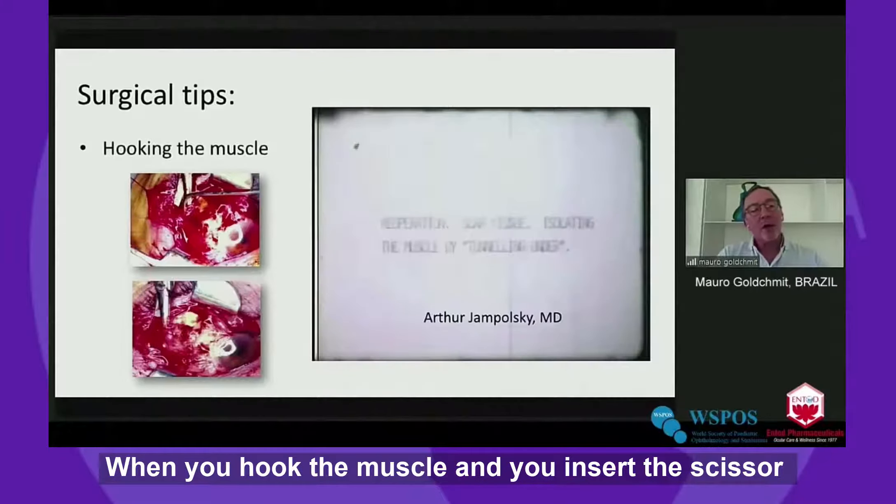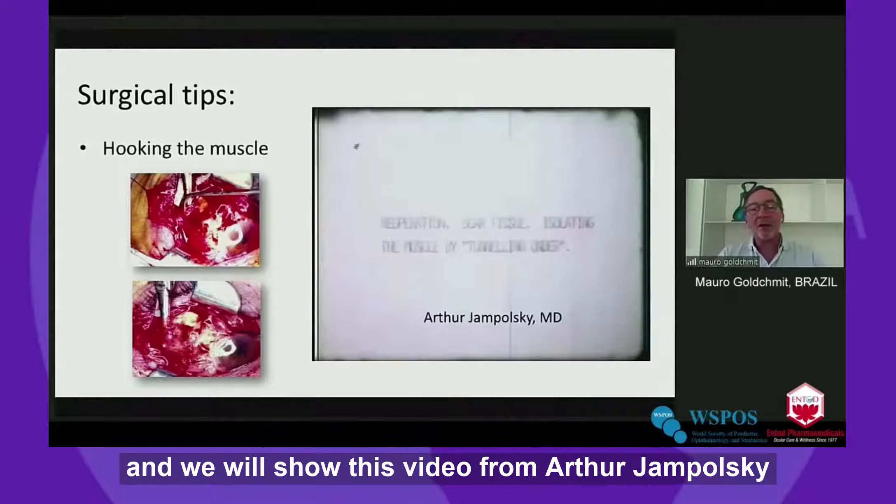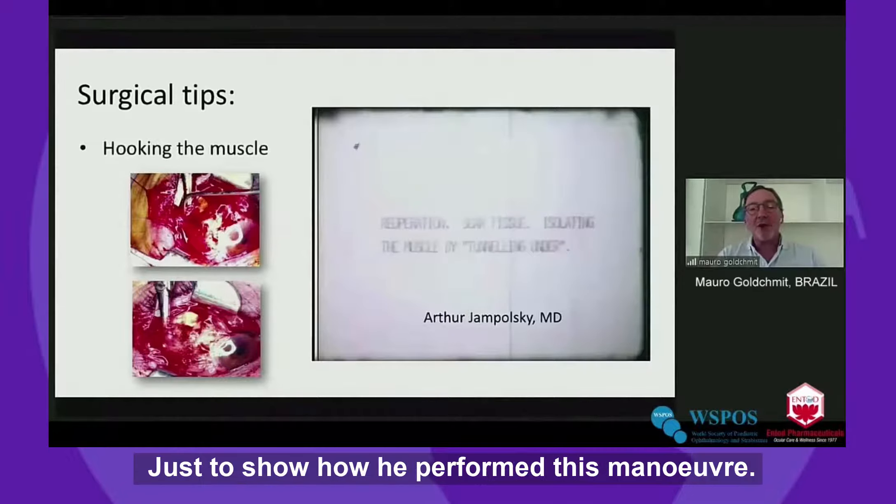When you hook the muscle and you insert the scissor, you can penetrate and hook the muscle through the tunnel of the scissor. We will show this video from Artur Jampolski that he gave me more than 30 years ago, just to show how he performed this maneuver.